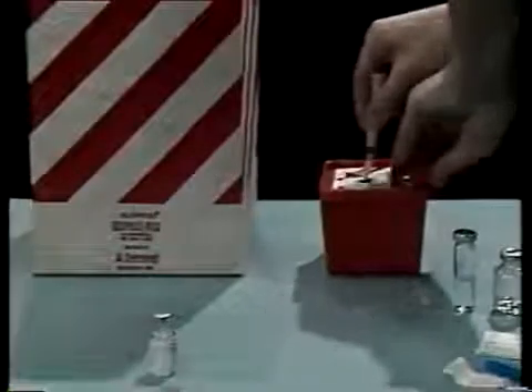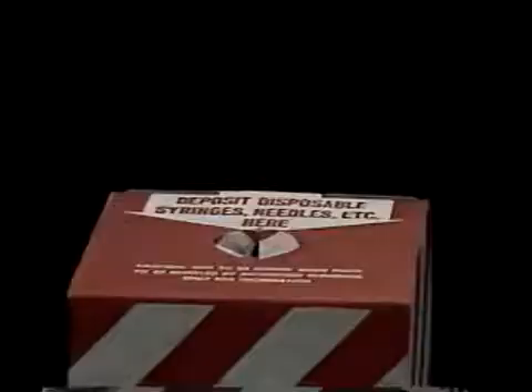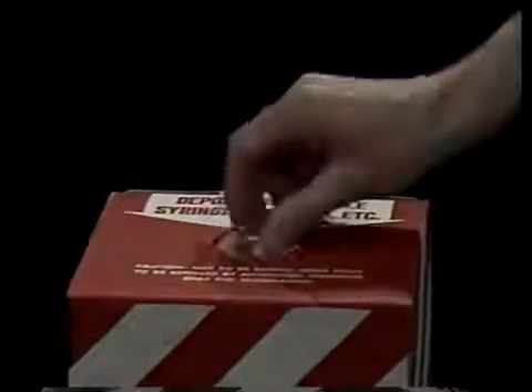The process of injection takes a very short time. We stretched out this process to make our teaching points. Now practice this task yourself.